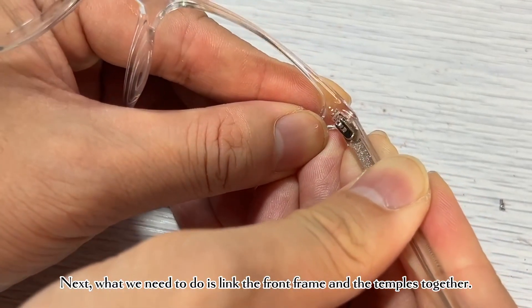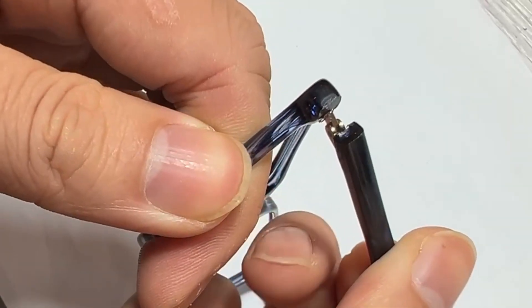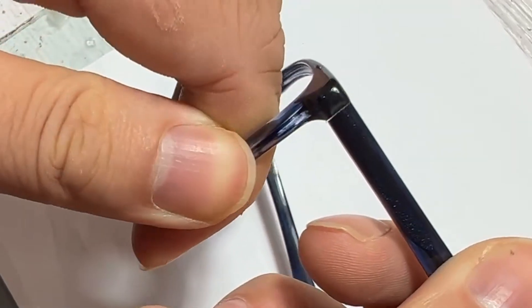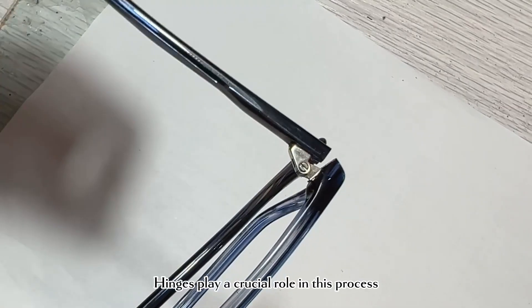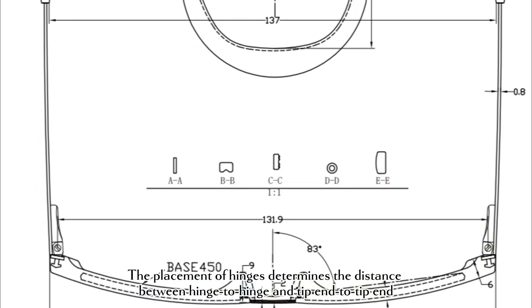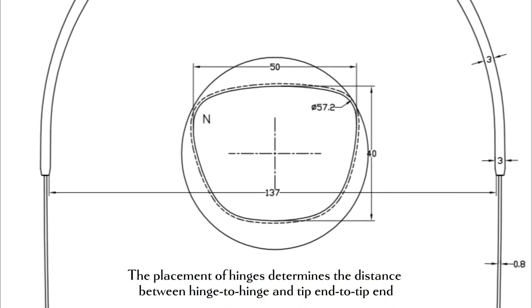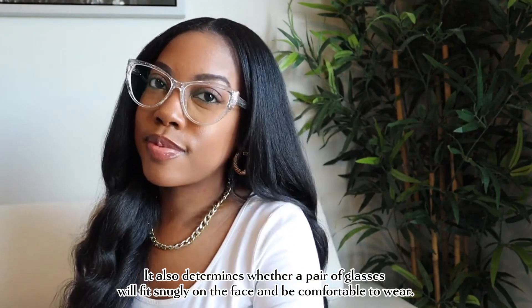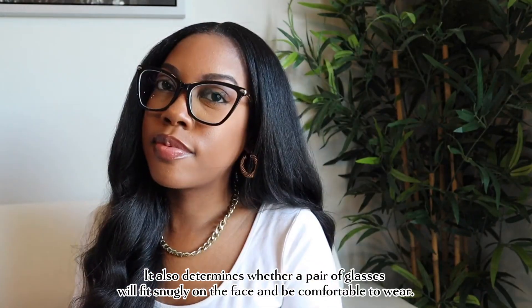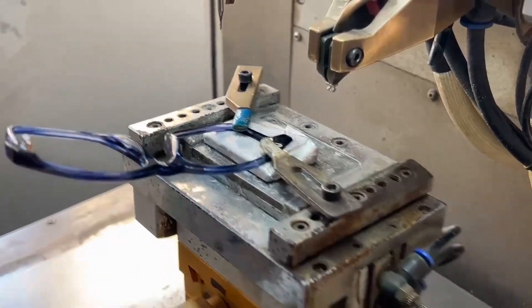Next, we need to link the front frame and the temples together and ensure they match well. Hinges play a crucial role in this process. The placement of hinges determines the distance between hinge to hinge and tip end to tip end. It also determines whether a pair of glasses will fit snugly on the face and be comfortable to wear.